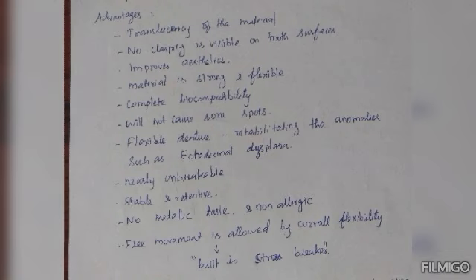And what are the advantages of flexible denture over conventional partial denture? It gives translucency of the material and no clasping is visible on the tooth surfaces. It gives improved aesthetics, the material is strong and flexible, complete biocompatibility, and will not cause sore spots because it is very soft.